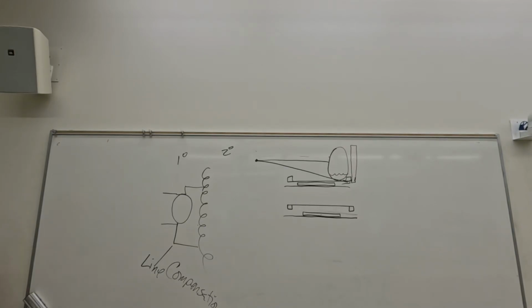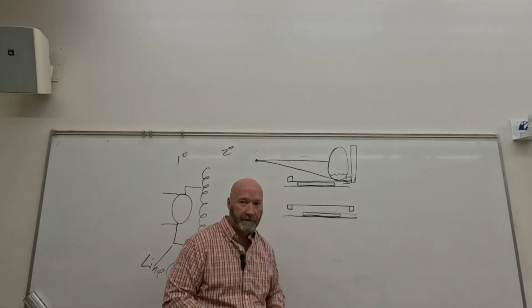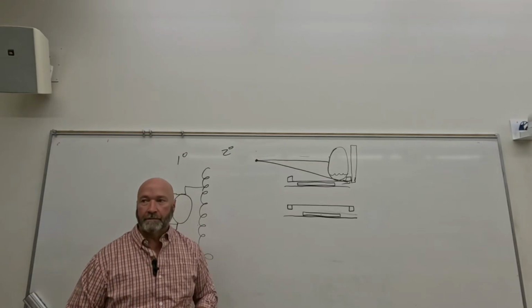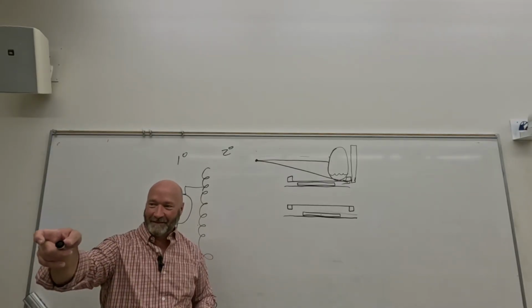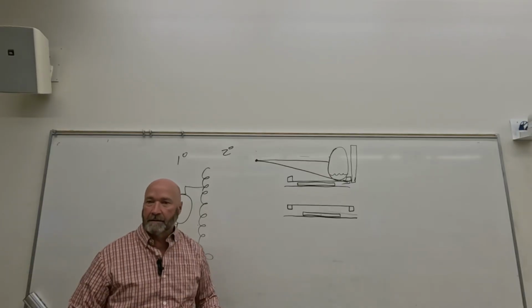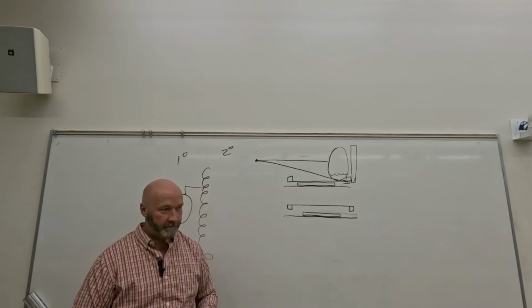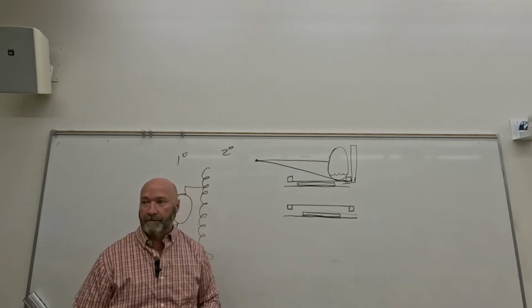Have you noticed that the way you move your tabletop around differs in different rooms? What do you notice about RF rooms? If it's a fluoro room, what do you notice? You've got to push the button, right? You don't move it with your hands. It's motor driven. And the other ones, what do you do? Step on one. Exactly. So what we have is motor driven and free floating tabletops.